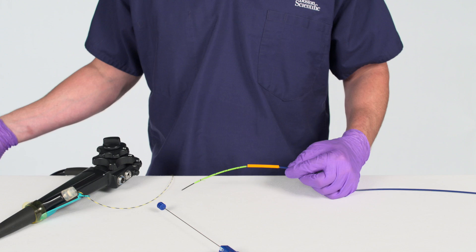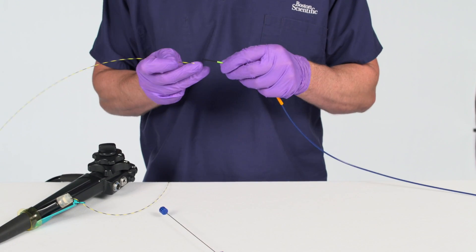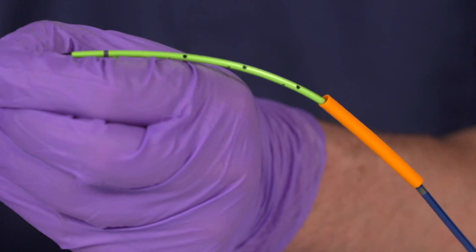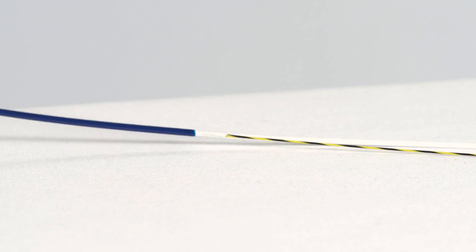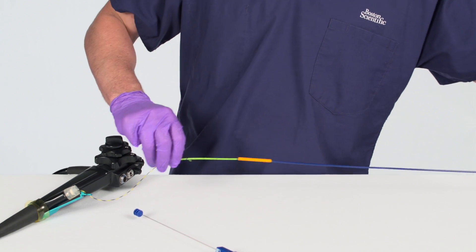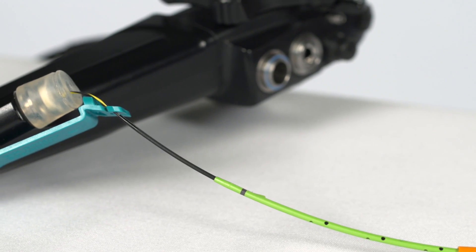With the guide wire positioned and locked in the RX Locking Device, backload the delivery system over the guide wire until the guide wire exits through the guide wire exit port. The guide wire exit port is denoted by a change in push catheter color from blue to white. Grasp the guide wire and slide the delivery system over the guide wire until it reaches the RX Locking Device.